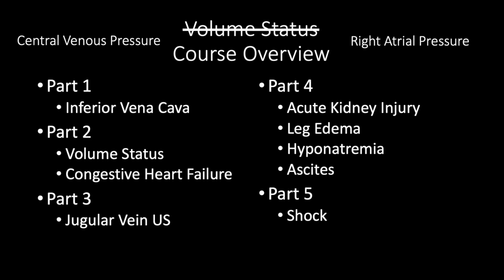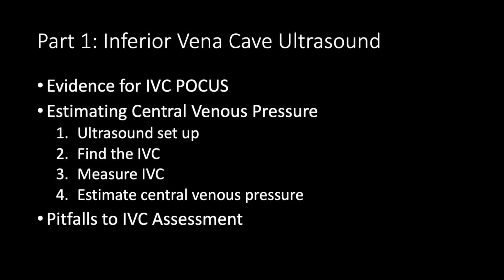As a hospitalist, I don't deal with shock all that much, but I definitely get some hypotensive patients a couple times a month. And assessing central venous pressure can be helpful in those cases as well. Now, this is a comprehensive course. There's a lot of information in all these 5 parts, so take your time. We've broken it down into segments, and you can always come back and review this material anytime. All right, let's get started with Part 1, Inferior Vena Cava Ultrasound.